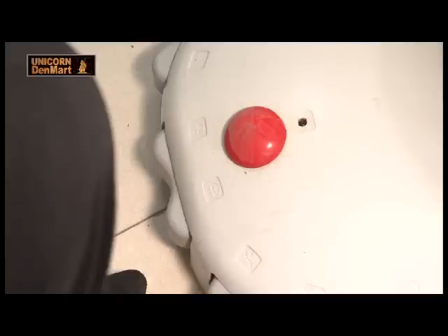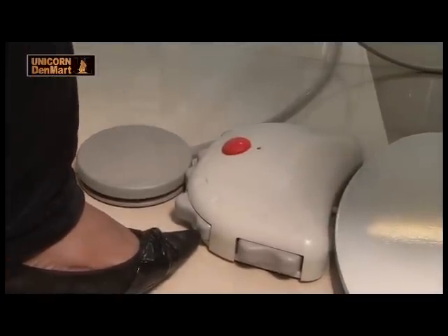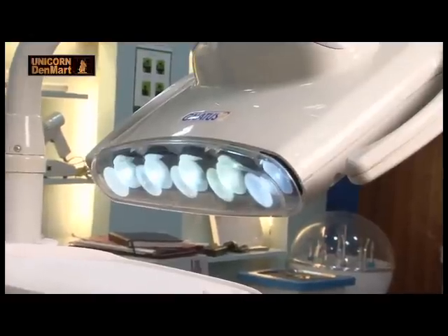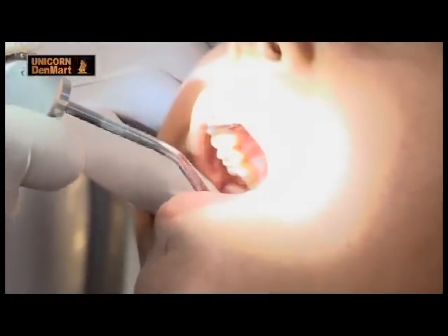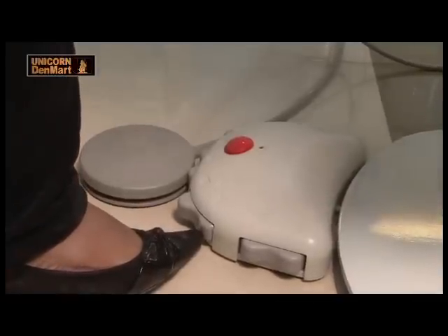The unit comes with various independent switches to control the working of the white and cold 5 LED light, which has a power of 35,000 lux, providing greater illumination of teeth and surrounding structures in the oral cavity.